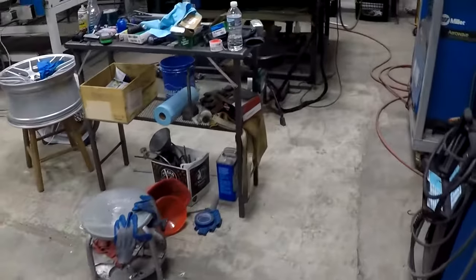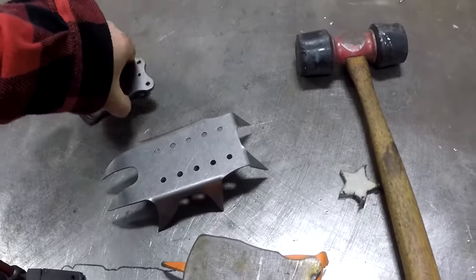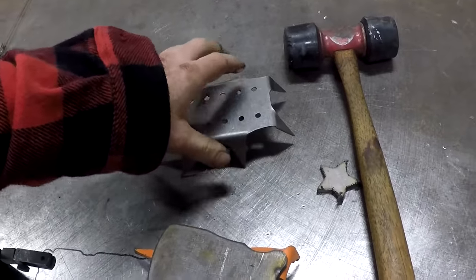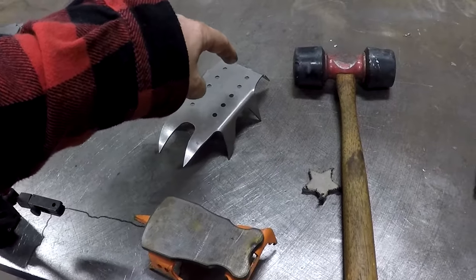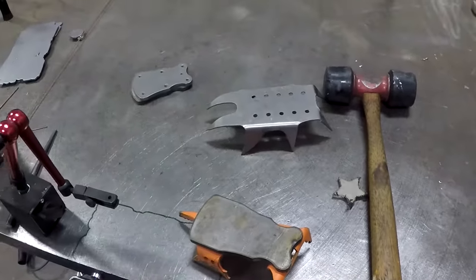And he does have some more feedback for the one I had done here, this crampon, which the prosthetic bolts right to. It's super light. This is more for mountaineering, and this is what was sent out to Nepal, and will probably eventually be used on Everest come May.